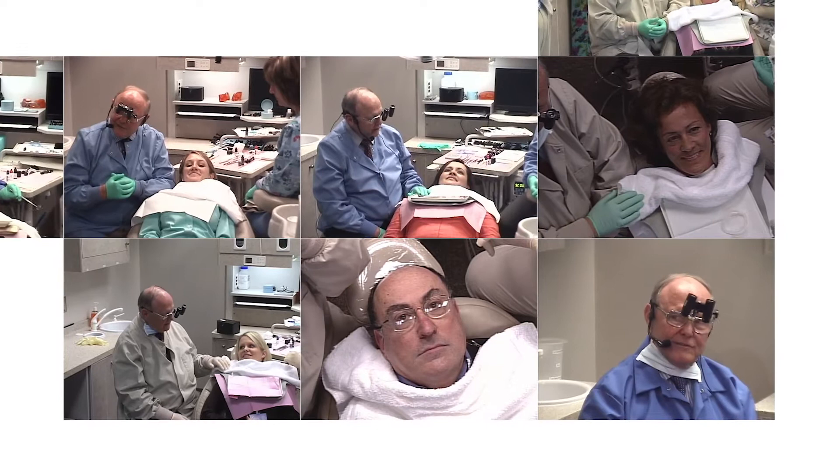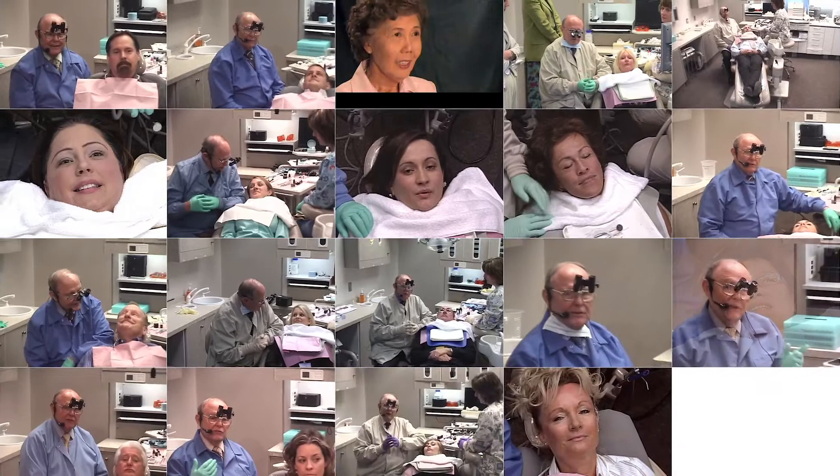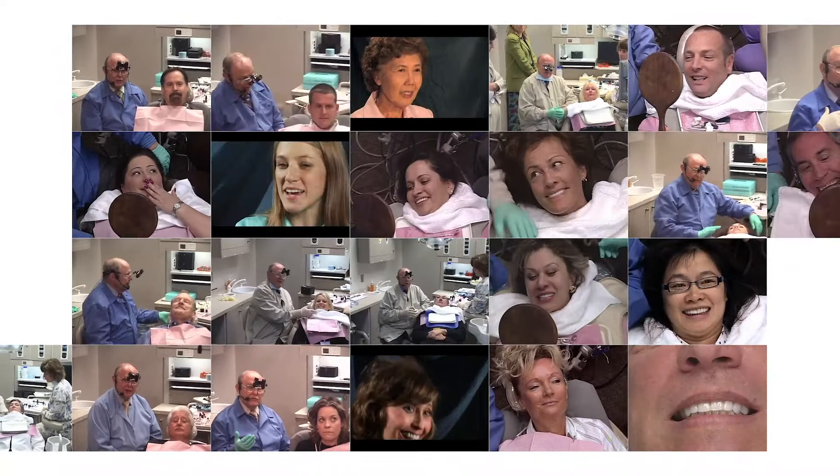Boston, Kansas City, San Francisco, Montreal, Munich, Germany, London, and Santa Maria, California. Now we're going to place 10 lumineers — 8 lumineers today on our patient.